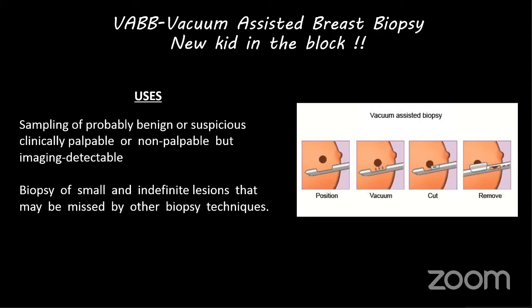And it is here, when vacuum assisted biopsy pulls out the entire lesion, that we need to place a marker clip after the vacuum assisted biopsy. So this is the idea: vacuum assisted biopsy, removal of the entire lesion, putting of the clip, and then the surgeon operating through that clip as guidance.